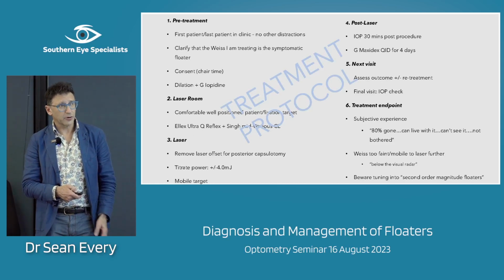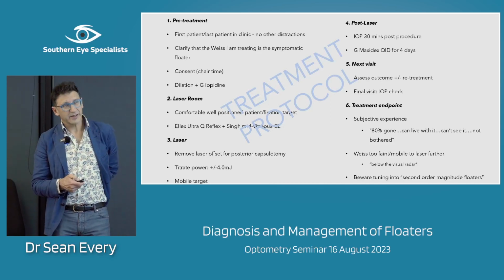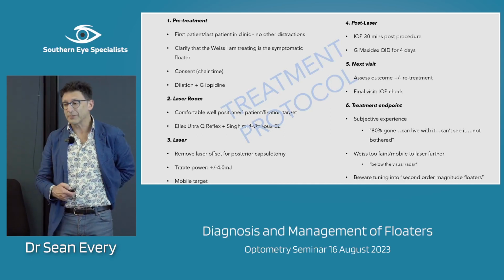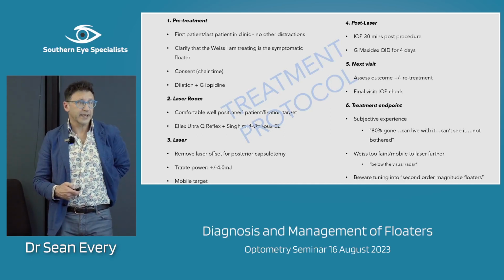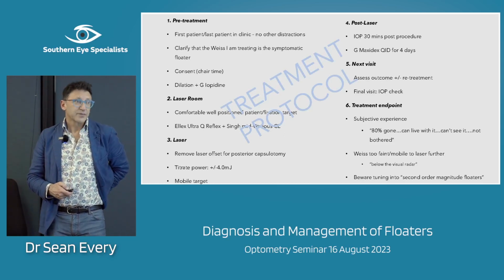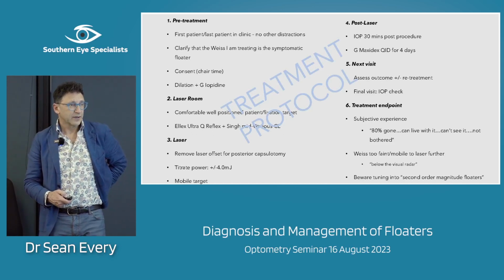As I've talked about, it's a mobile target. When I started, I used to check the pressure 30 minutes after the procedure, but I'm pretty conservative about how much energy I pump into the eye, so I've stopped doing that. I give them Maxidex 4 times a day for 4 days, and then they come back for the next visit, and we'll talk about the number of visits.